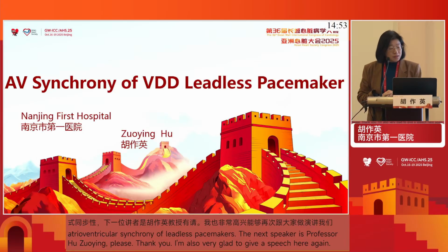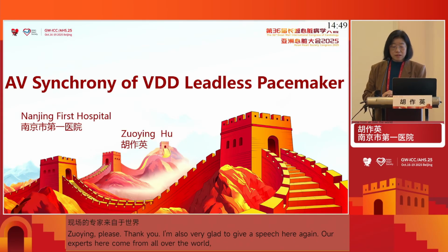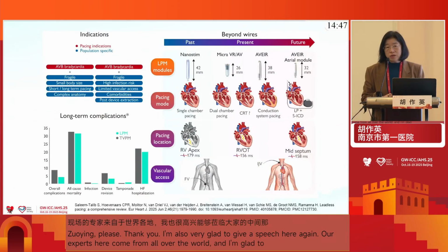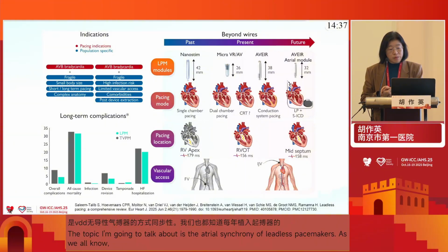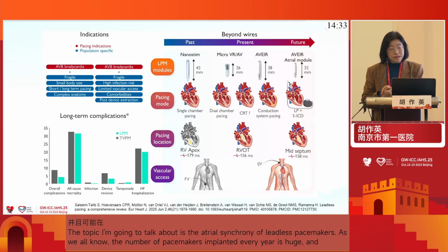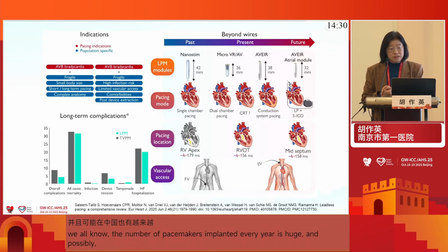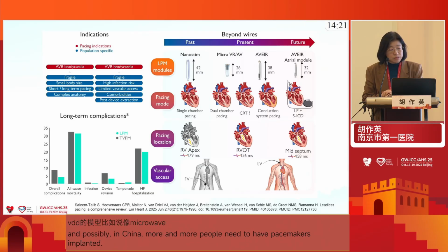And this is AV synchrony of the VDD leadless pacemaker. We all know that we have to implant many pacemakers, and more and more leadless pacemakers will be implanted in our countries, and some patients need the VDD modes. So the Micra AV can provide the VDD pacemaker mode.